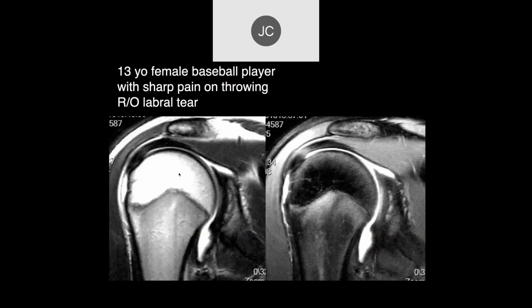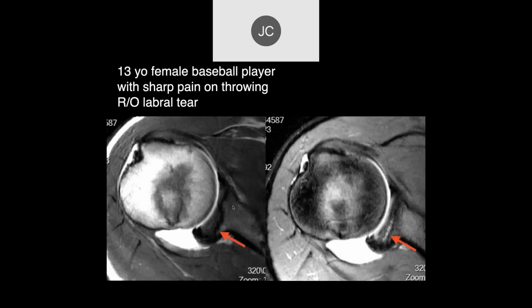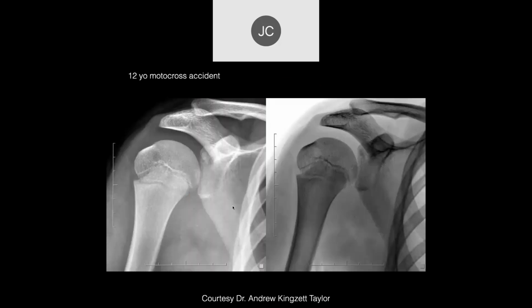So this was a girl, 13-year-old, but remember that female physes close earlier, and so this actually is a closed physeal plate, so it's not a little league injury. This is more like an older adolescent, young adult injury, which is impaction of the glenoid. Was that underhand type of pitching, John? I'm assuming it's underhand, but I don't know, John. Yeah, okay.